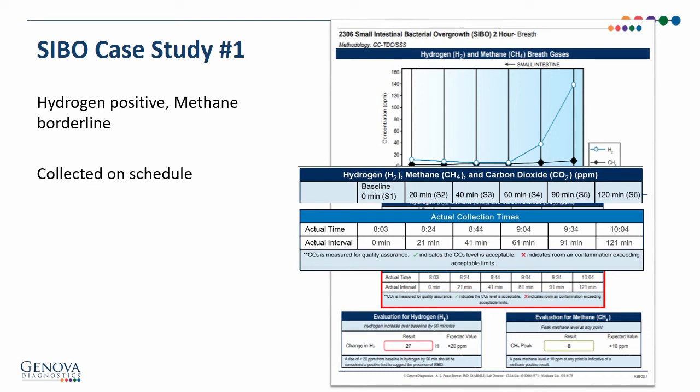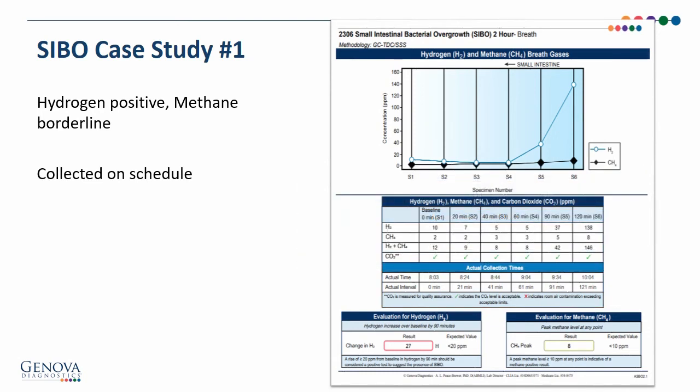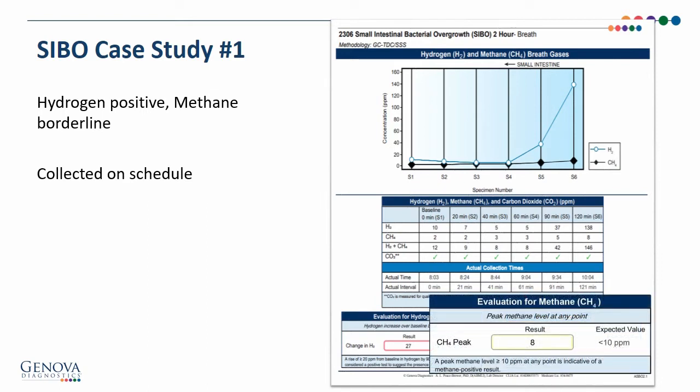She has some methane present, and even though it was less than 10, a finding of 3 to 9 may be significant in a symptomatic patient. Constipation is associated with methane, and this patient has chronic diarrhea, so methane may not be affecting this patient.